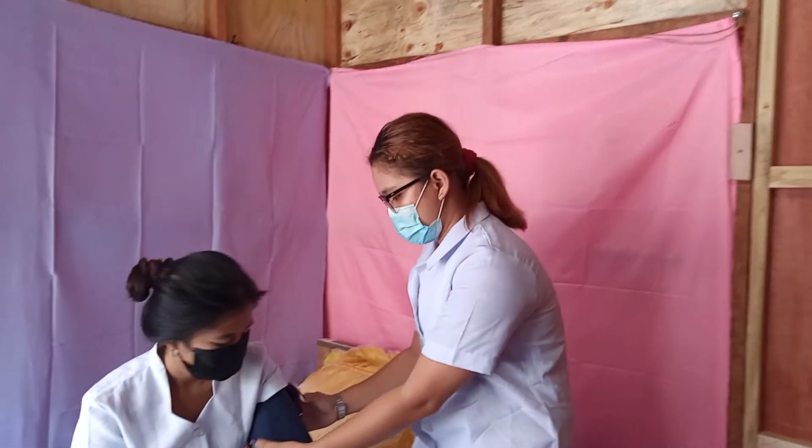Then, the next procedure is wrap the cuff around the arm smoothly and snugly, not too loose, not too tight. Rationale: a smooth cuff wrapping procedure gives equal pressure and gives accurate readings. A cuff too loosely wrapped will give inaccurate readings.